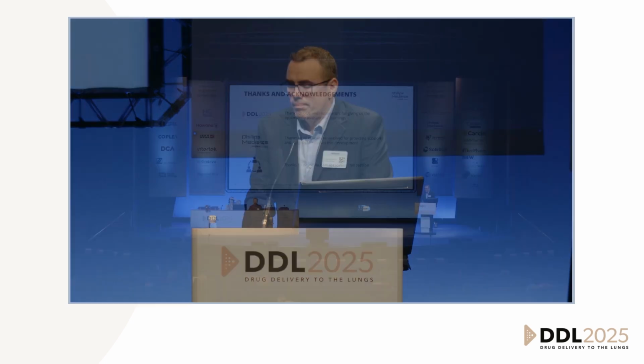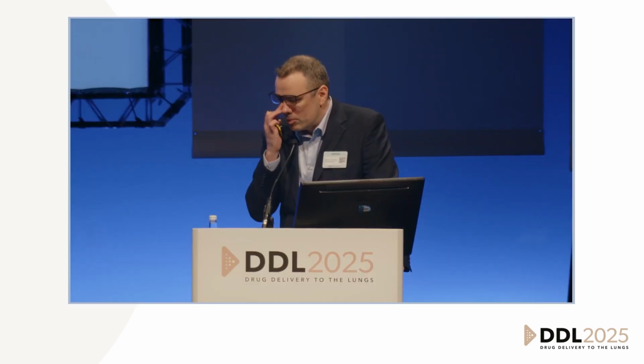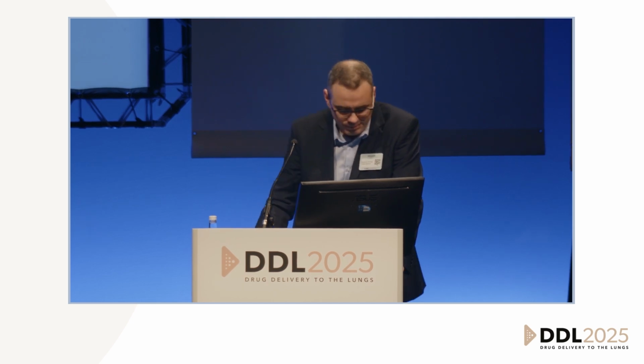There are some reasons for this also on the shape. Since we are on the balls, it's a shape that maximizes drag. So it promotes a lot of deagglomeration also, like the corners, you could see their impacts against the ball. So it helps a lot with deagglomeration.